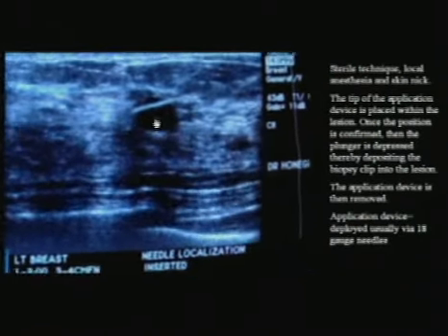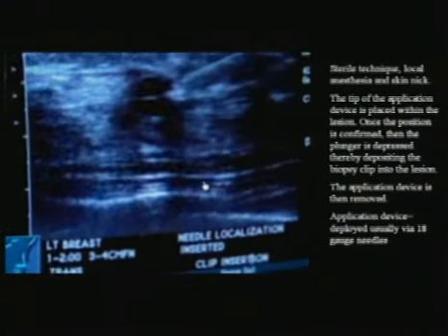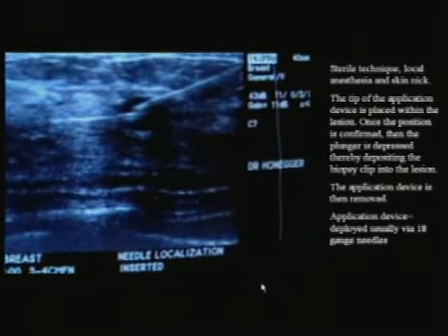This is also the collagen. And this is put through the skin nick that was made for the biopsy, and this should already be numbed with lidocaine. Oh, I didn't mean to do that again, sorry. So again, we're parallel to the chest wall. You want to make sure you don't go into the lung.